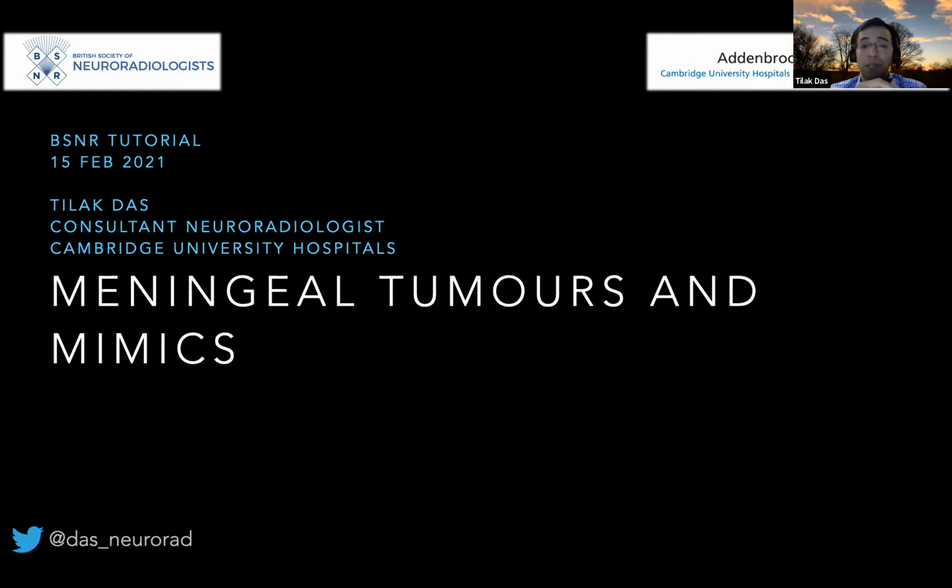Some places will try spectroscopy, although I don't know how well that works with post-surgical change and, of course, small volumes of tissue. Perfusion, diffusion, again, I don't have that much experience of in the context of meningiomas. Meningiomas are generally highly vascular, so I'm not sure it's that helpful. And as you say, you normally delay the imaging a bit so that you don't have the normal problems with blood products, because you hope that most of it has cleared by then.